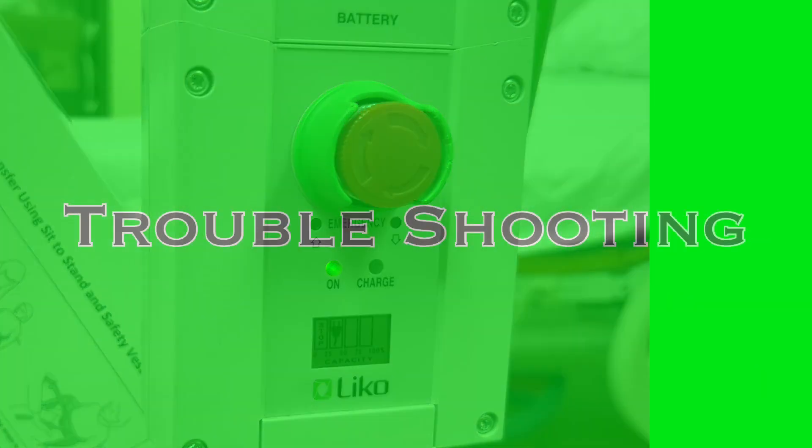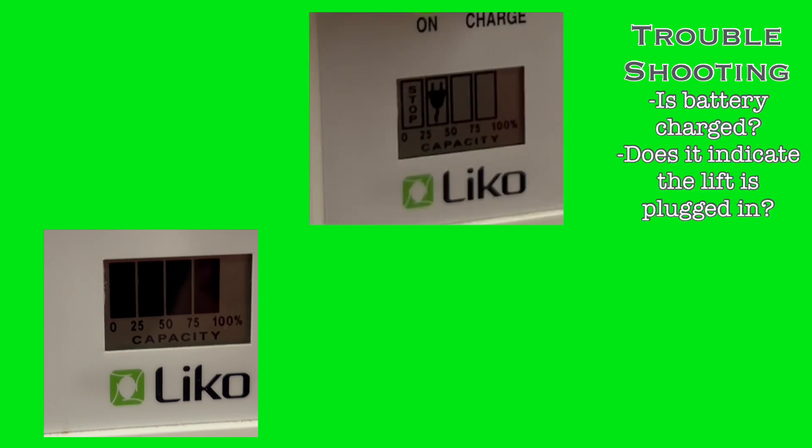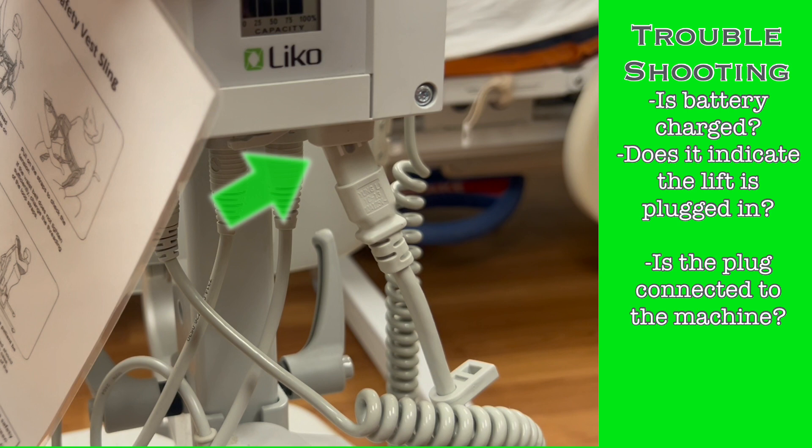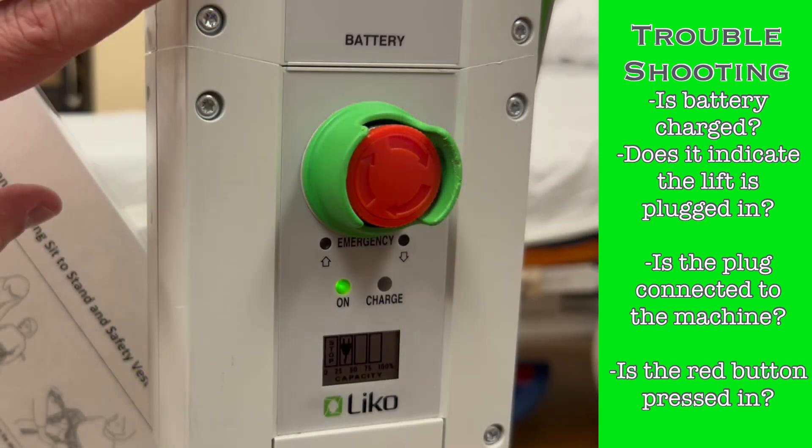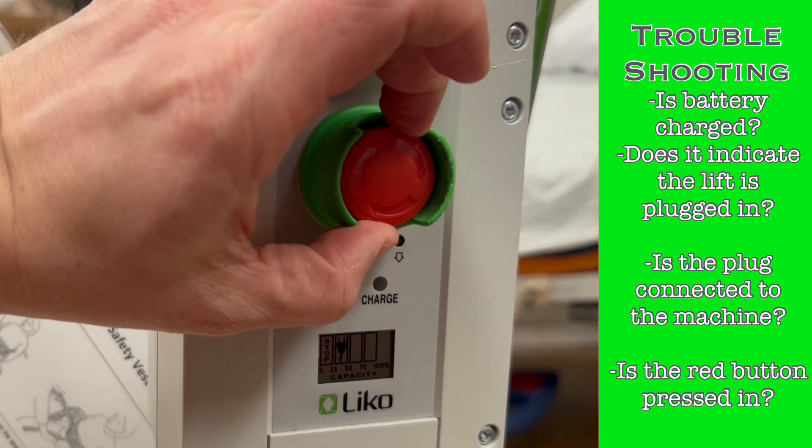To reactivate the electronics once the patient is disconnected, twist the red button clockwise a quarter turn and you will feel it release as it returns to its unpressed state. Then plug the lift in to charge the battery. If the electronic controls don't seem to be working, do some quick troubleshooting. Check the battery screen — does it indicate a charged battery or show a plug image? If not plugged in and no charge is shown, the battery is probably dead; plug it in and the yellow charge LED should illuminate. If the cord is plugged in but there is nothing on the screen and no LEDs, ensure the plug is properly inserted. If still no response, the battery may be completely depleted and needs replacement — contact Biomed. If the battery is fully charged but controls still aren't working, check if the red button is pressed; turn it clockwise to release it and you should have full function of your controls again.